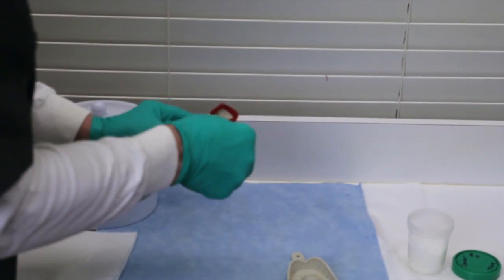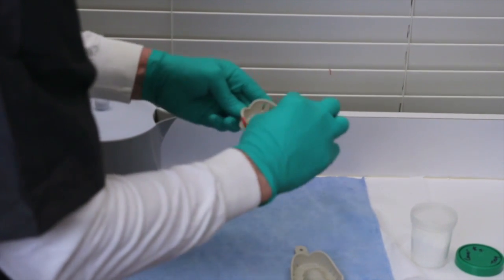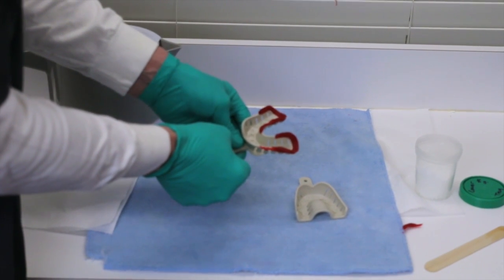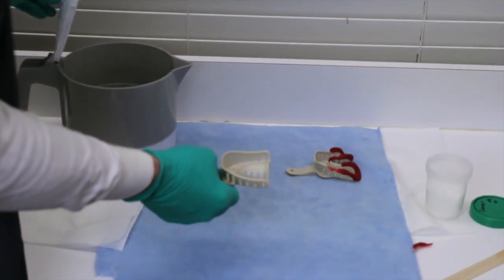So we're going to add wherever is appropriate to get the trays extended, and then we can take this to the patient's mouth. I'm not going to demonstrate that here, but we can take it to the patient's mouth and verify that it's covering what we need to. And of course, after that's done, we're going to again spray the tray with either hold or tack material for the adhesive.